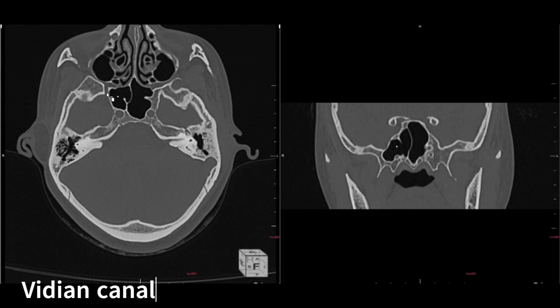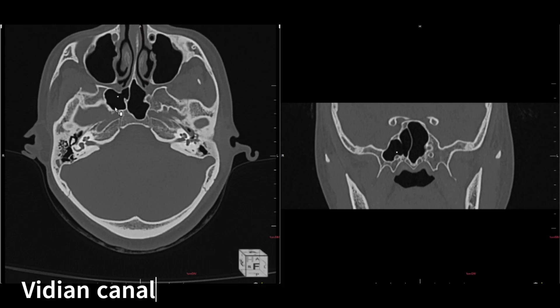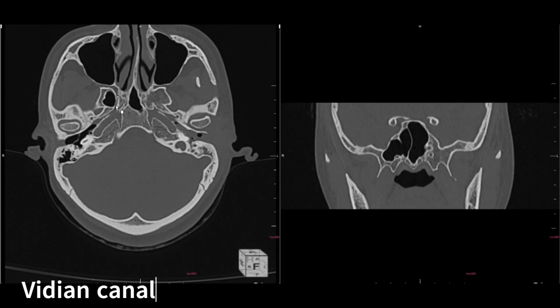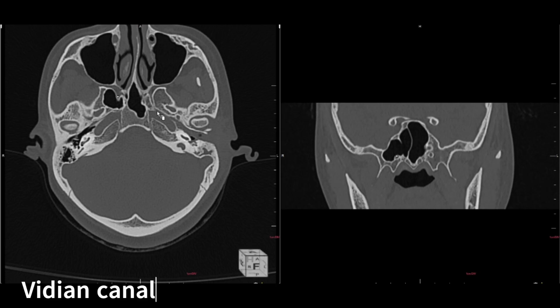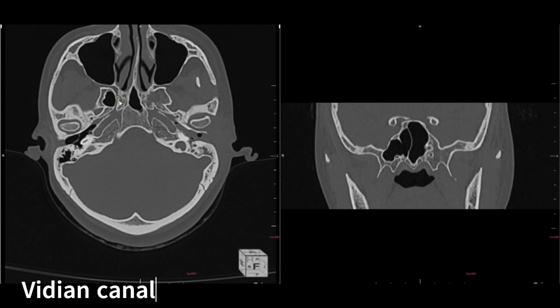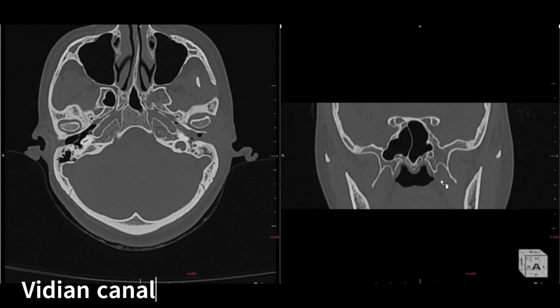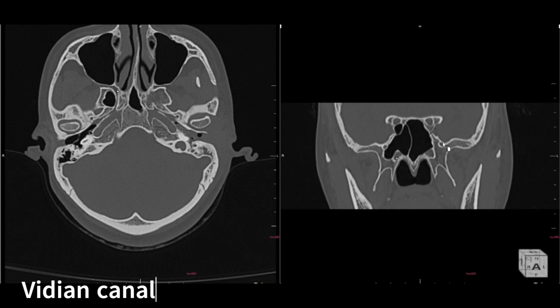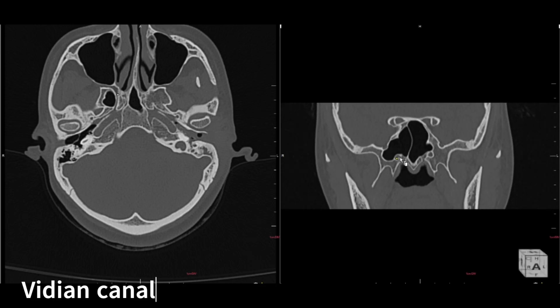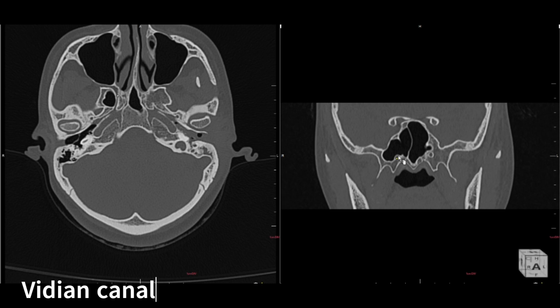Next we have the vidian canal. Don't confuse it with the foramen rotundum. The sphenoid sinus is here, and as you move down below the sphenoid sinus you can see another canal similar to foramen rotundum — that is the vidian canal. It comes at the end of, and below, the sphenoid sinus. On the right side the vidian canal is almost into the sphenoid sinus. So the vidian canal is at the base of the sphenoid sinus, while the foramen rotundum is adjacent to the sphenoid sinus.